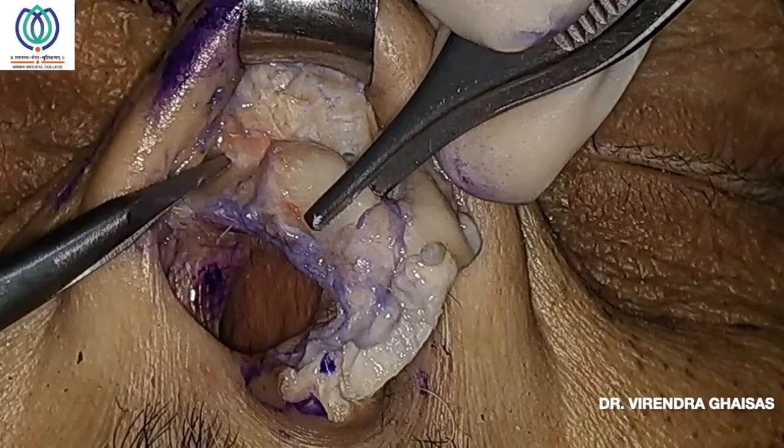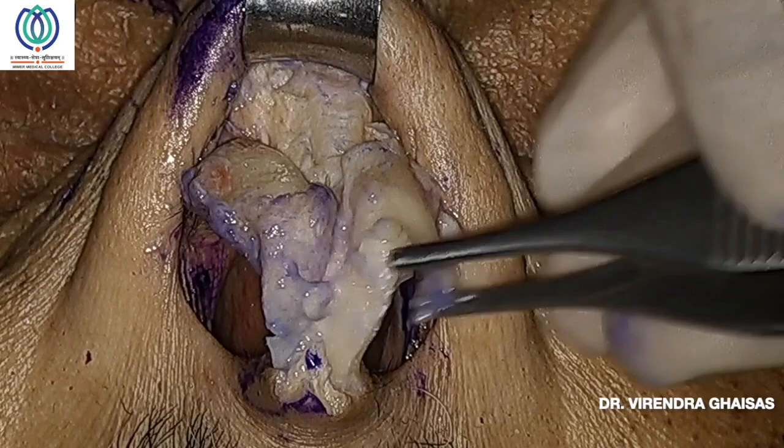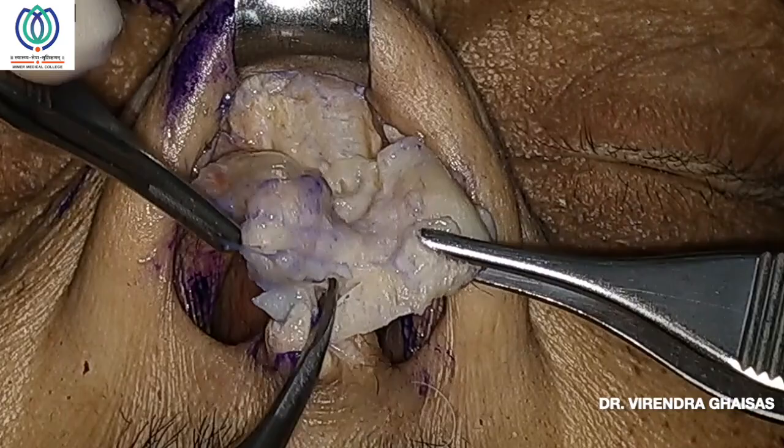So this is important if you want to strengthen this lateral crura with a graft, then this pocket is really important. That's a vestibular skin below, which is very tightly attached, and you should dissect it very carefully in cases where you have to relocate the lateral crura, or where you have to strengthen the lateral crura with cartilages. So that's a dissection towards the midline, towards the septum.